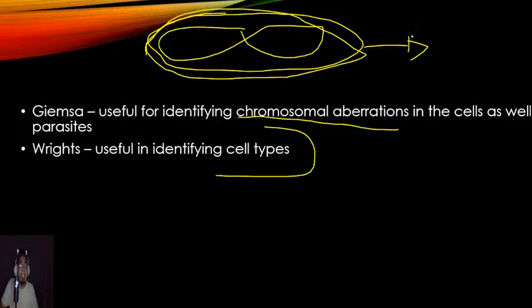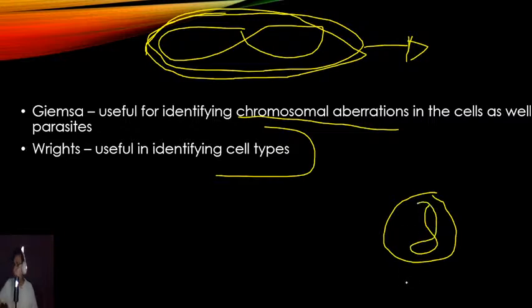And it's usually seen in patients with a chromosomal aberration. Figure of 8 in an RBC. Sometimes it looks like this. Anybody? Common yan na question din, di ba, Sir Marco? Yung RBC morphological anomaly with a figure of 8.